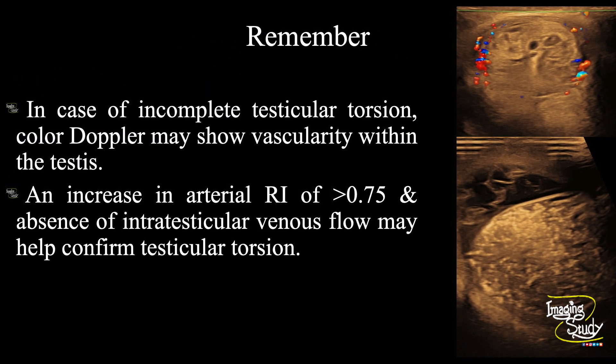Now the take-home message. In case of incomplete testicular torsion, color Doppler may show vascularity within the testicular parenchyma. In that type of case, an increase in arterial resistive index of more than 0.75 and the absence of intratesticular venous flow may help confirm testicular torsion.